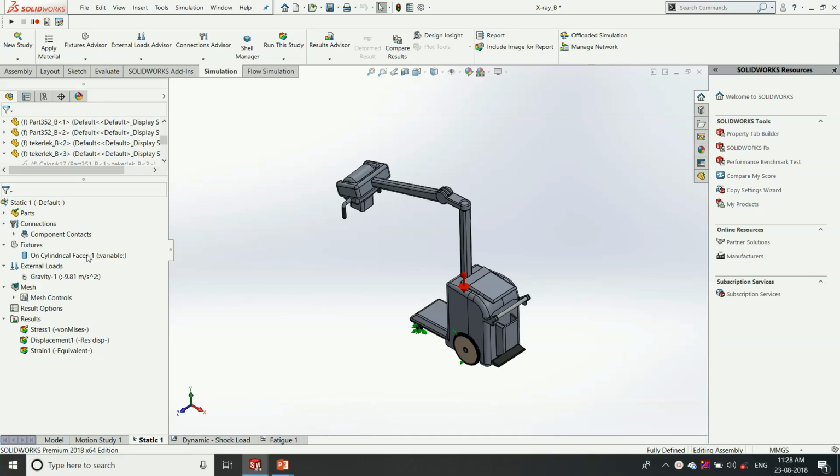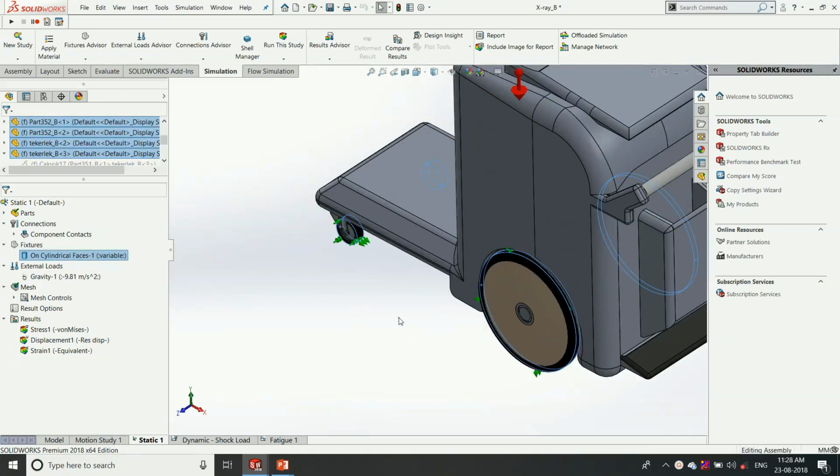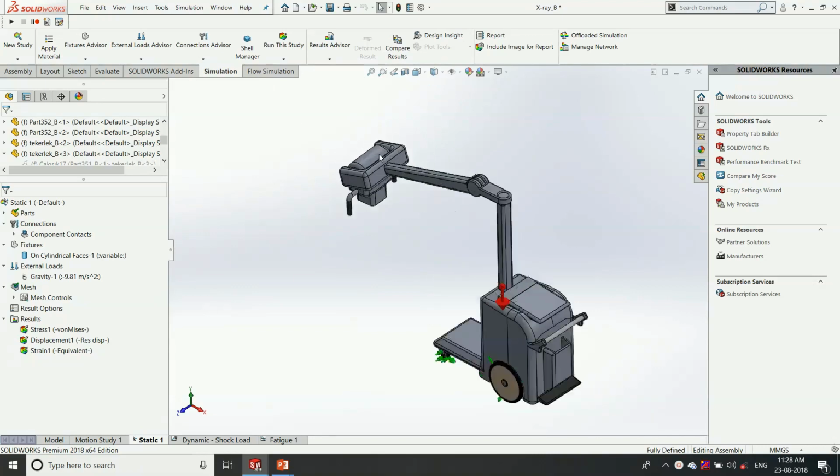So in the boundary condition we are going to apply the fixtures. So I applied the fixtures on the wheels, to mimic the stationary condition of the X-ray machine, because only the arm is going to move, and the base component will be stationary.